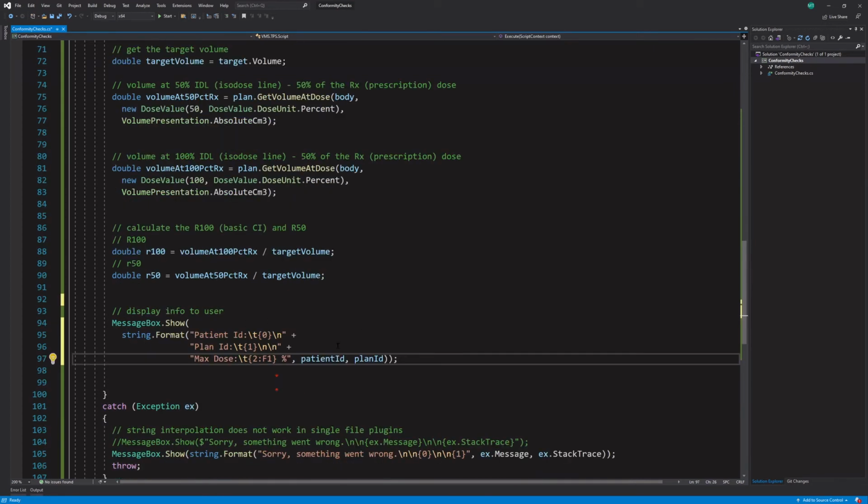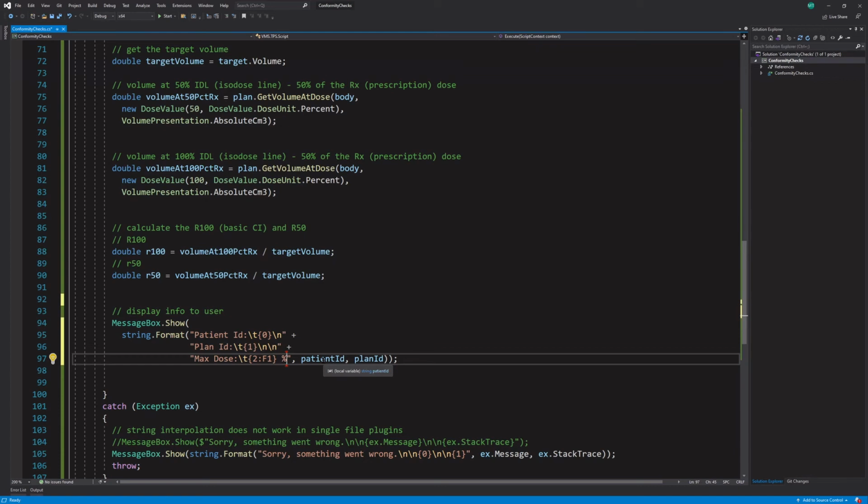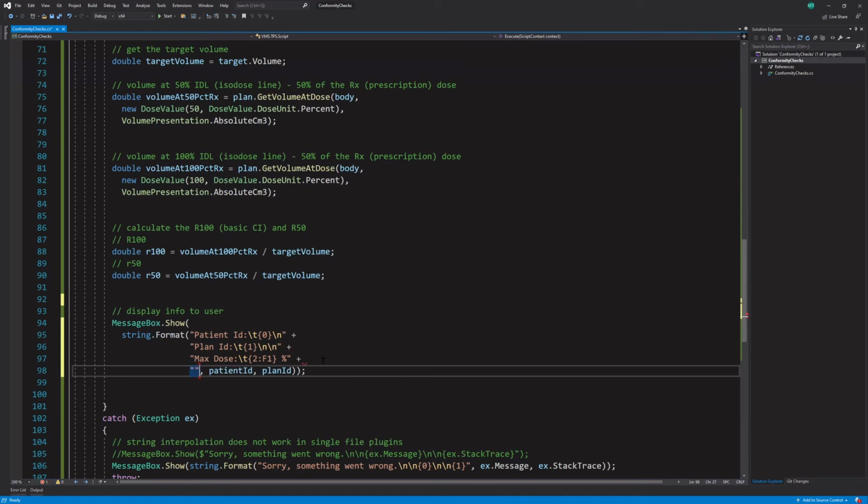So let's add max dose. I'm doing it after the new lines so that it looks like how we're going to do it. Because I'm inside the string and I hit enter, it's closing that portion of the string, and it's adding a plus sign to concatenate it, to add it together. And then it's adding the next line. So it's something that it's doing for us. The other thing, if we wanted to, we could say plus, and then go down here and add a string ourselves, right? But instead of that, it's nice to be able to do that. Okay, so that's the max dose.